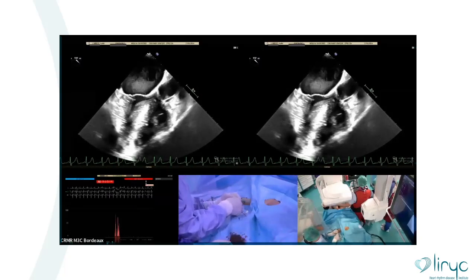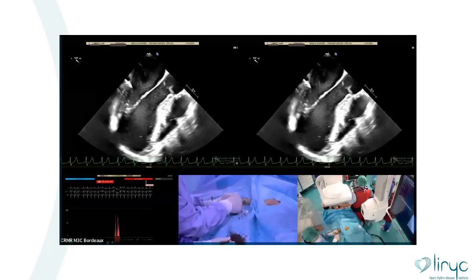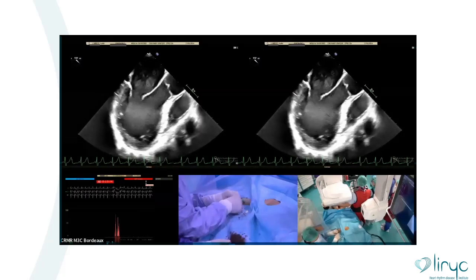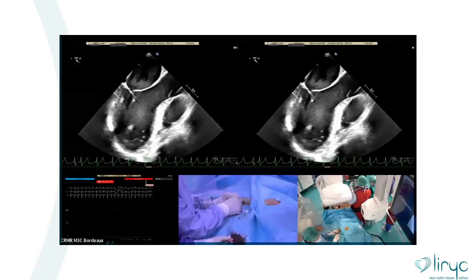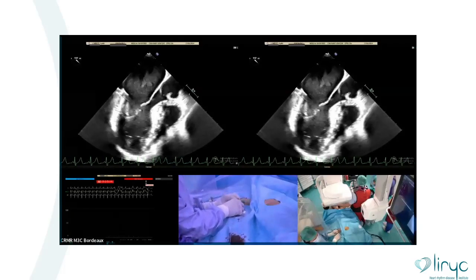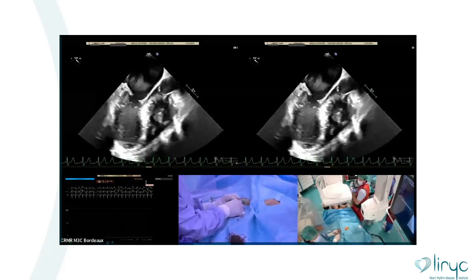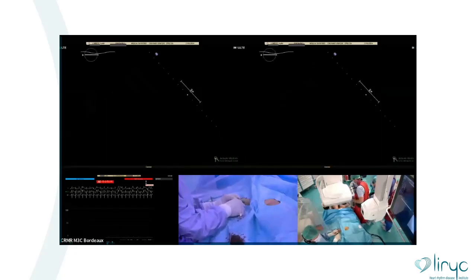Catheter too high. Catheter advance. I don't see your catheter anymore, guys. Did you pull back your catheter? A little bit, I think. No, stop there. Show us the aortic arch. You put it back too much. Let's go to the bench. TTE, yeah. Aortic arch. Yeah. Let's do that.